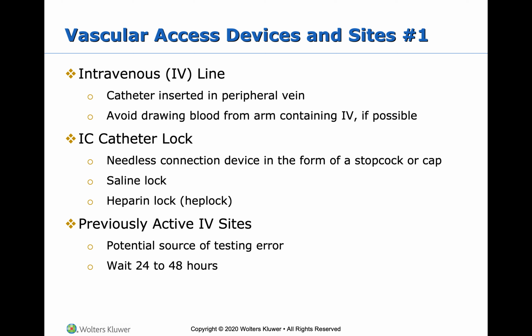However, like I said, if you want to be a good, awesome phlebotomist, it's important that you know and are aware of some of these things. I had a nurse draw from a PICC line, which we're going to talk about in a little bit, which is also an open system. So it needed to be flushed with saline before the draw and flushed with saline after the draw. And I noticed that she did not flush the device after the draw.